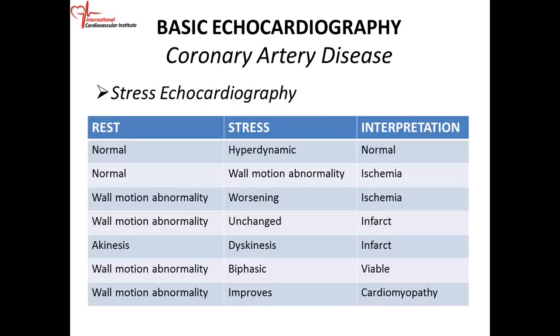So when you do all of that, the patient exercises and you achieve at least the target, but when we do a stress test, you should try and do what we call a symptom-limited stress test. What we mean by that, whatever symptom the patient was having outside, whether it's chest pains or shortness of breath, you're going to exercise the patient until the patient becomes symptomatic.